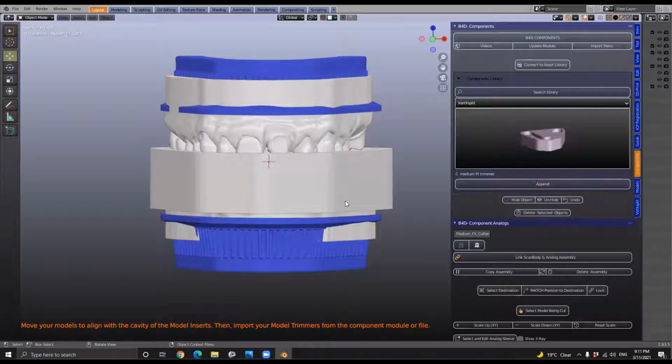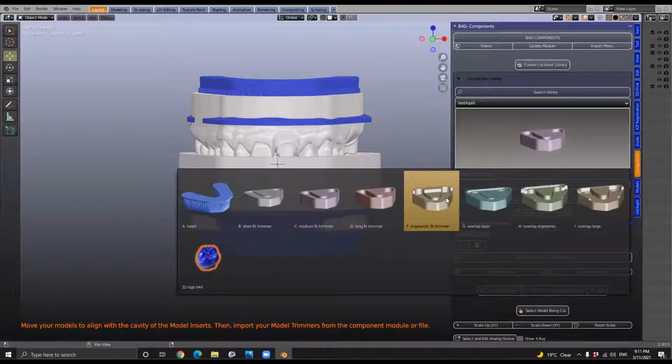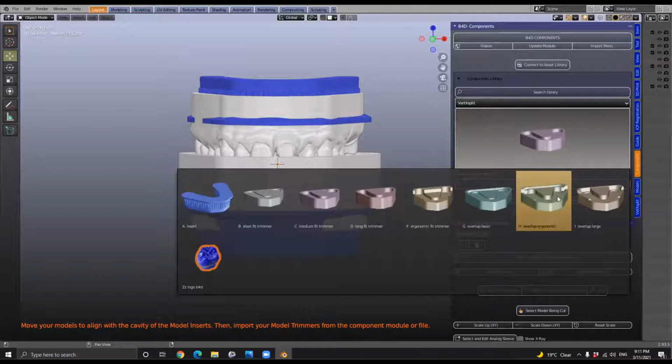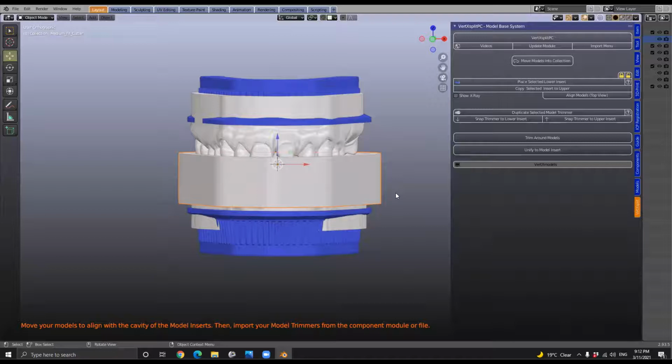Okay, so if you've got dies, for example, the teeth are jutting anteriorly forward. One of those cutters has got an opening in front and it's got heels at the back. Then we've got the overlapping one. So if you've got an overly large dental model, you'll use the overlap. So the serrated insert will still fit into the cavity, but it will overlap the actual plastic injection mold slightly. That eliminates the need to immediately come out with another mold, which is larger or overly large size. So we've got 3. We thought, okay, let's just stay with one size model base, and then we can still work with larger size models just by overlapping it slightly.